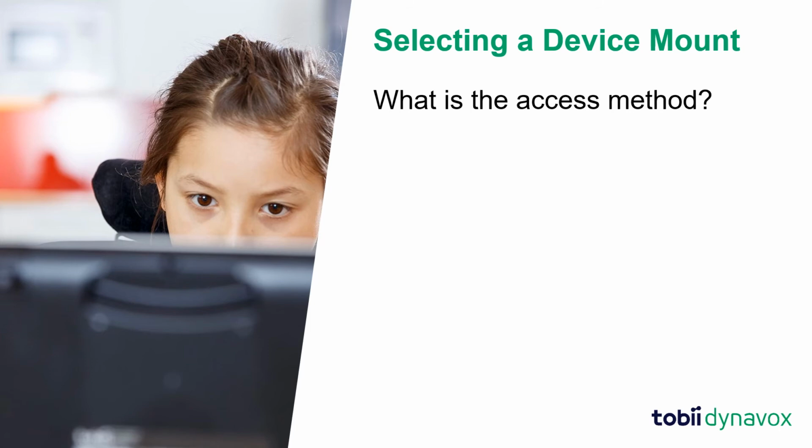Knowing the access method will help determine the best mount. For example, a wheelchair user who is using eye tracking will need a mount that is sturdy and does not bounce during use. A good type of mount to reduce this bounce would include an S-pole vertical tube. An ambulatory touch device user may use a desk mount that is flexible to the various positions needed throughout the day in their different environments.